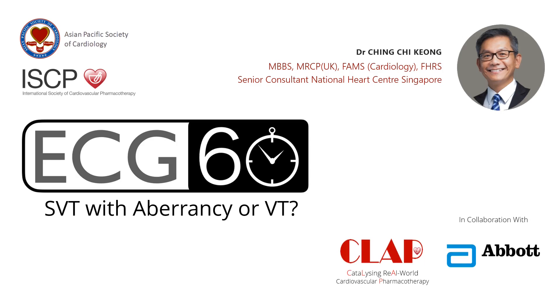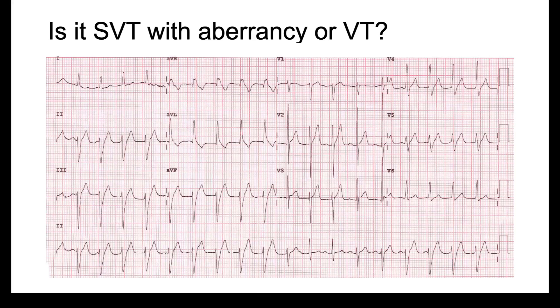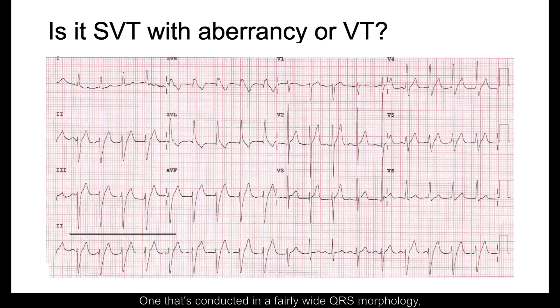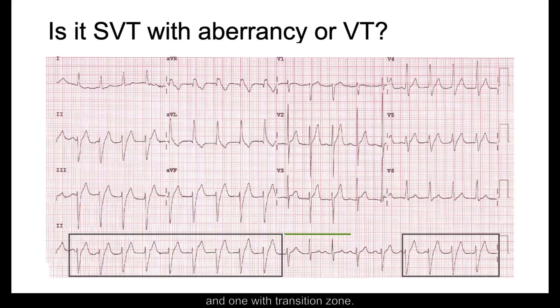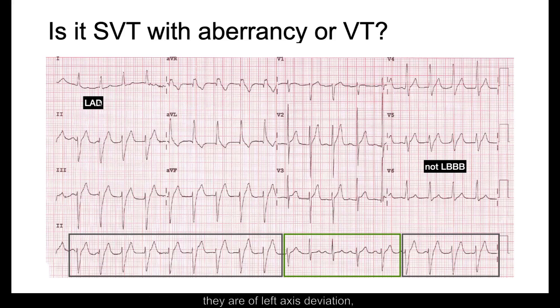ECG in 60 seconds: is this supraventricular tachycardia with aberrancy or ventricular tachycardia? A quick survey of this ECG shows two main zones — one conducted in a fairly wide QRS morphology, and one with a transition zone. We know that those conducted in the wide QRS morphology are of left axis deviation, and it is not left bundle branch block.